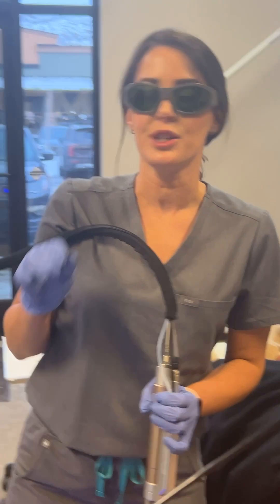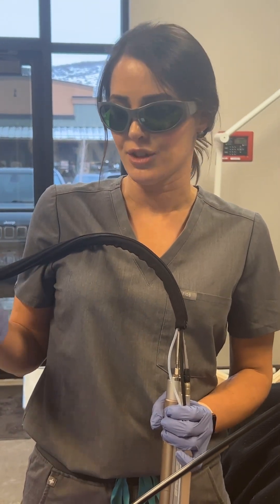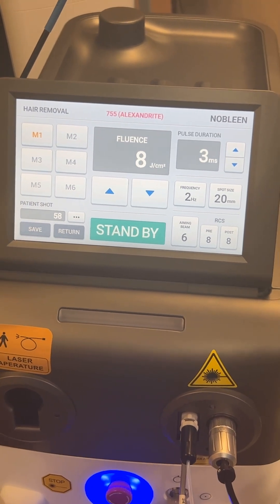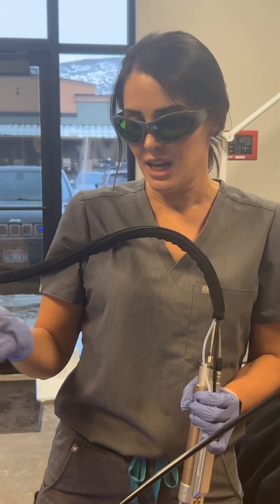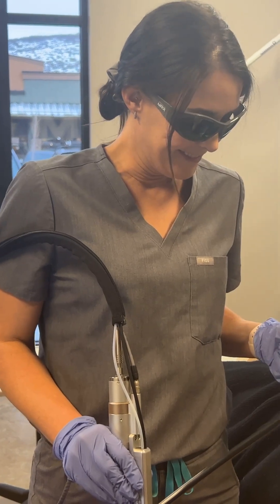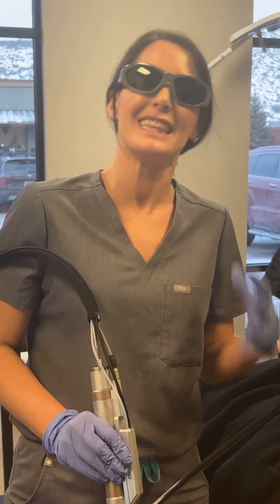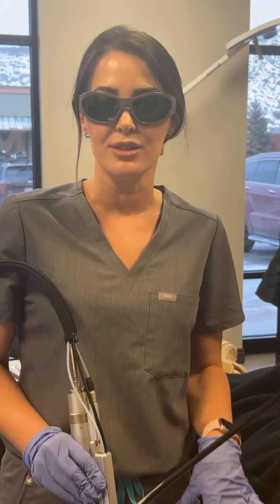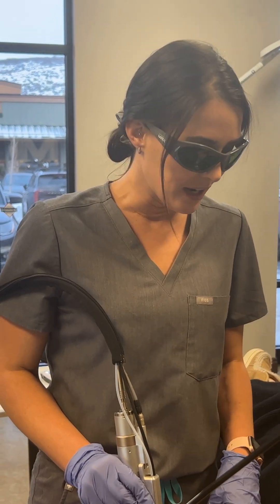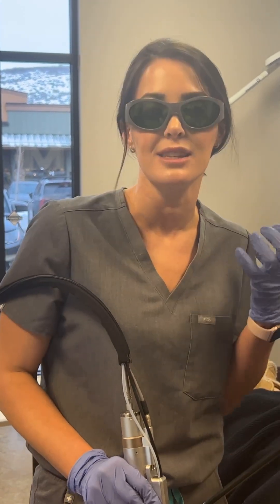We are using a 20 millimeter spot size, that was actually 2 hertz, 3 milliseconds, and 8 joules — with the 755 Alexandrite. We had our aiming beam brightness at a 6, and our pre and post cooling was an 8. As you can see, she's very comfortable, she wasn't jumping. She has a little bit of follicular edema occurring, so this is a great response. Now we're going to go to the other side and we're done.